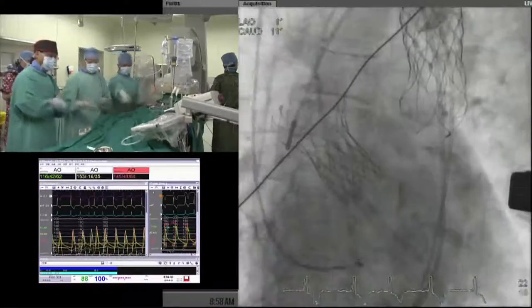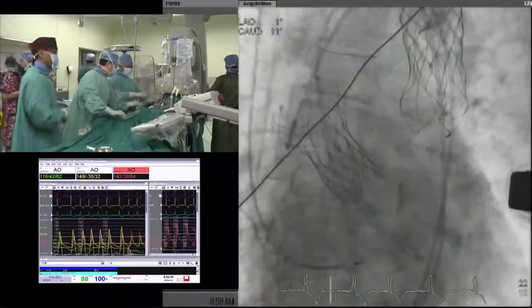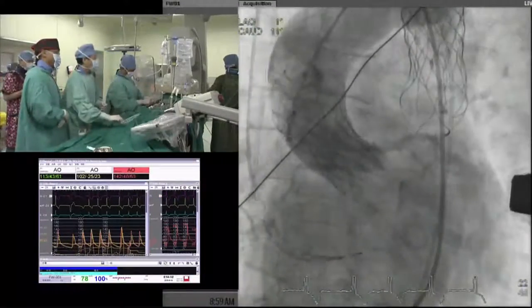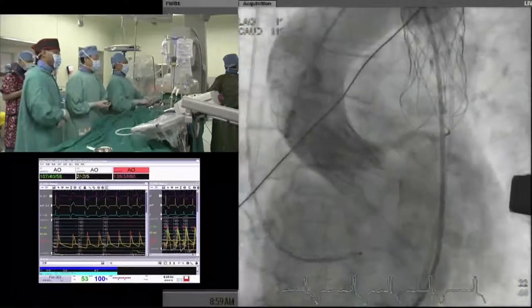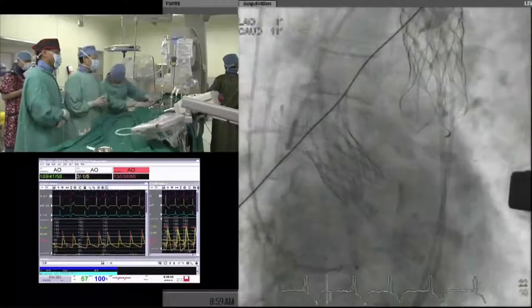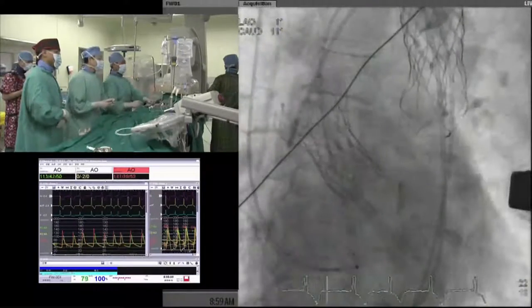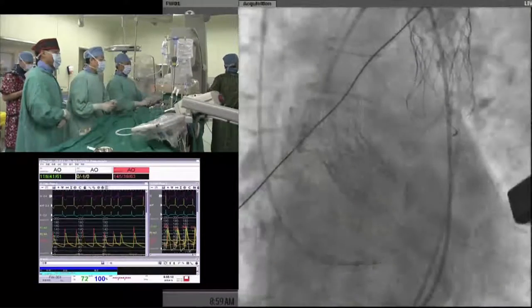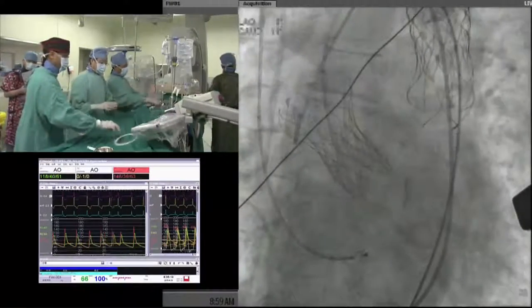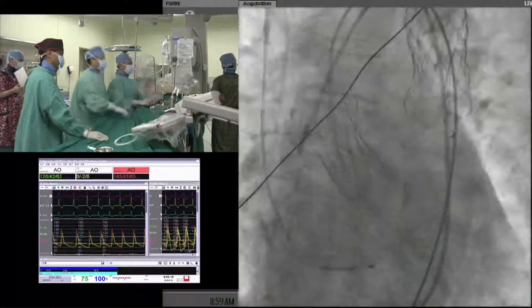So do the panelists have any suggestions? It looks like the leak is mild now, and the valve is relatively well expanded, and it's a little high, so I'd be reluctant to dilate it. Would people want to dilate this? It's too risky. Probably leave it alone at this point. People think it should be left alone. Just remove the pigtail from the LV, and do another aortography.